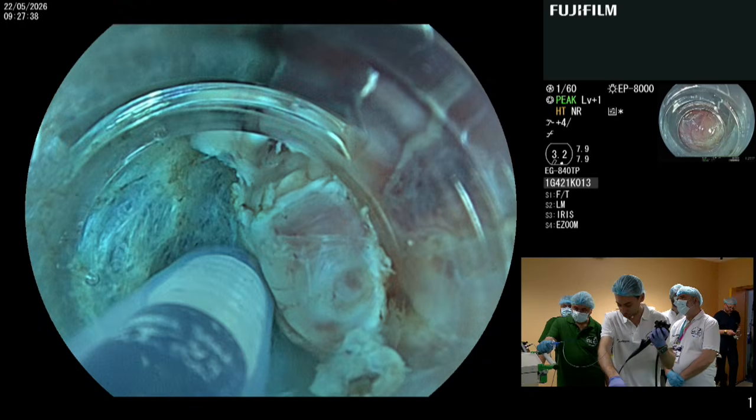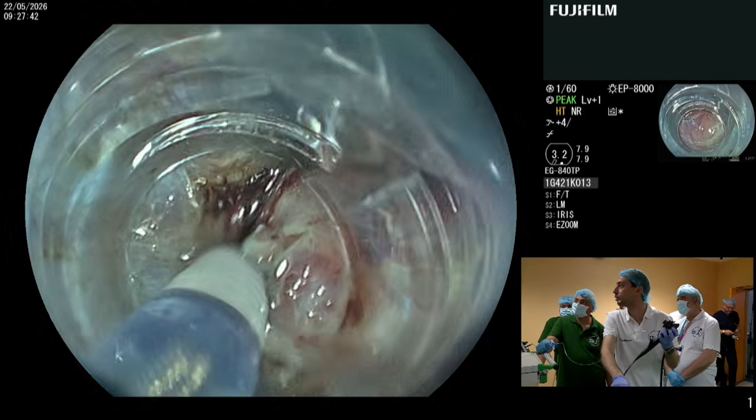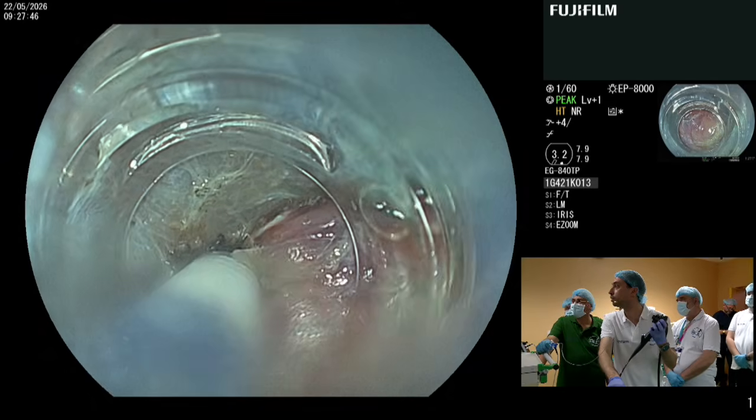Okay, now we have a better submucosal plane. Yes. Good. The bleeding here.